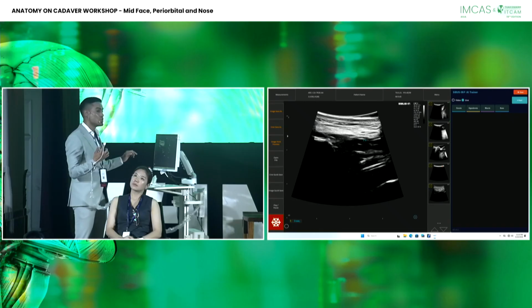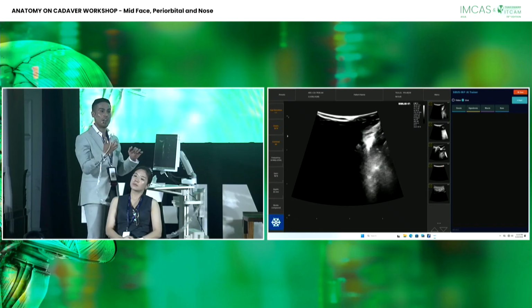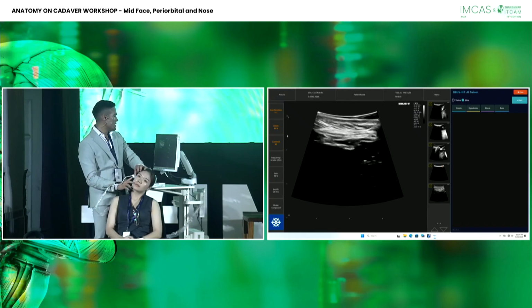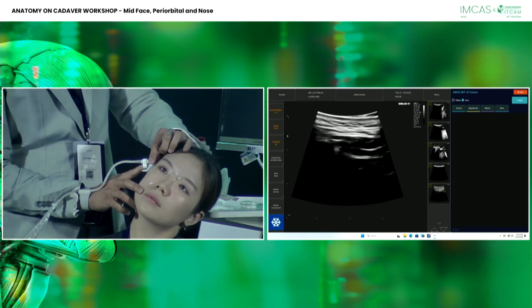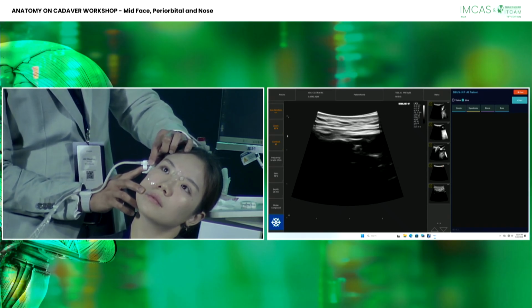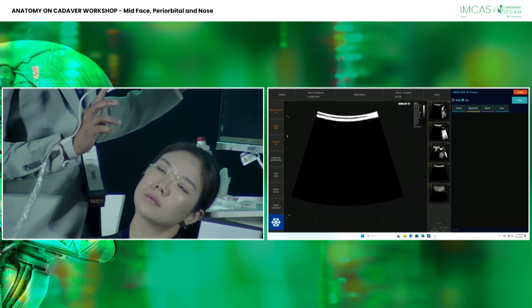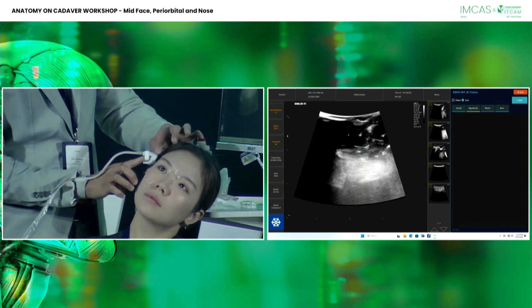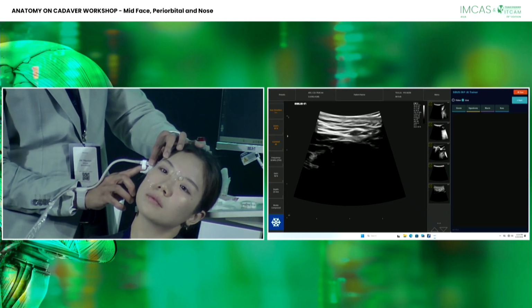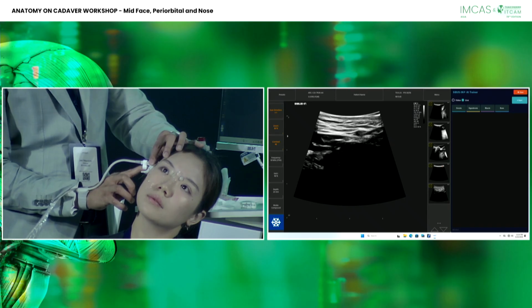If you overdo this, you will overfill the face. This is actually one of the areas that belong to the overfilled face complex of the midface. And if I go downwards, now on your left this white line is the zygomatic arch. It's a very short line. And if I go downwards, I'm going to change my scan direction. So your left side of the image is the zygomatic arch. Here, the zygomatic arch is right in the middle, this white line in the middle. On your left is the superficial temporal fat pad or the intermediate temporal fat pad.